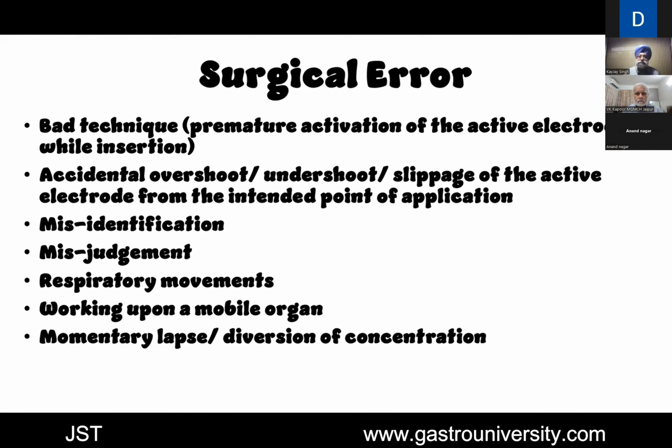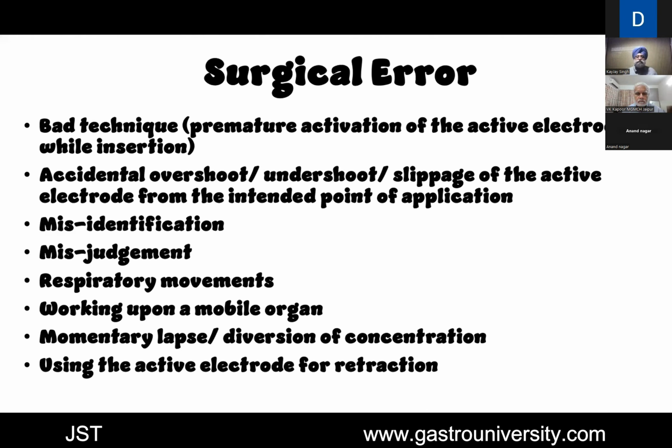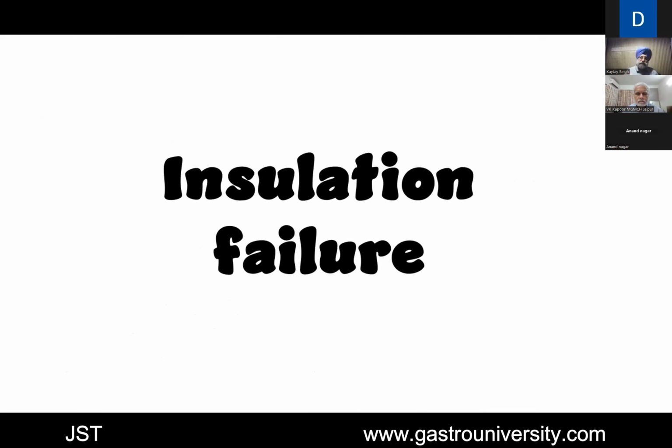You get a mobile call or somebody is shouting a message, and you are doing the cautery. That's not the way electrosurgical unit application has to be done. It has to be done with full concentration without any diversion. Another cause is using the active electrode for retraction. So many times we are in a hurry, we coagulate, and then with the same electrode we do a little bit of retraction. That's not to be done, because inadvertently it can be activated. So this is direct activation, the current application to an unintended organ.